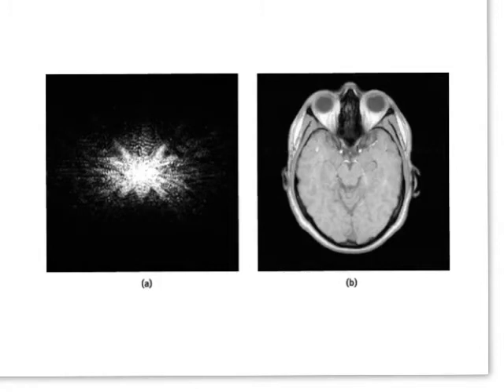Anytime you change the contrast or the color of an image, you're manipulating this junk right here, which we're going to call K-space. So if I were to start drawing lines in here, it would change the color and contrast of this image over here. I don't want us to get too in-depth into that, but I just want you to know that embedded in all of this raw data, there are also these attenuation profiles that we can manipulate. We can change those, just like you change the color of an image on your phone. It's the exact same process.